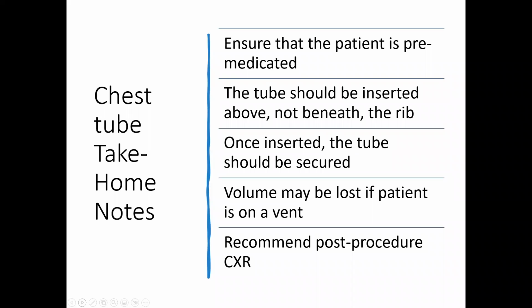Once inserted, the tube should be secured. Volume may be lost if the patient is on a ventilator. Recommend a post-procedure chest x-ray. Many times this is protocol, but on the exam, if it's part of what you would recommend next, you would recommend that a chest x-ray be done to help ensure that the treatment didn't cause another pneumothorax.